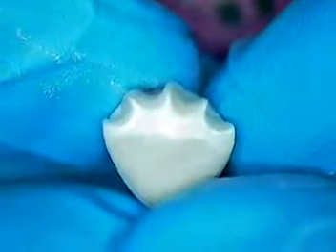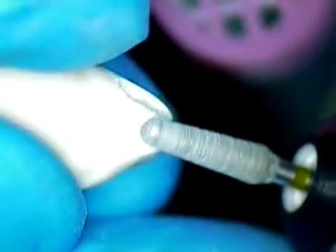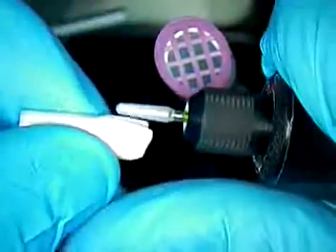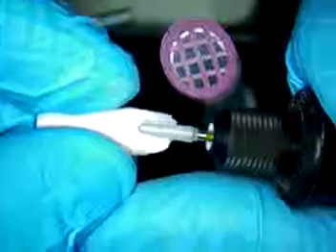That's the facial reduction done. Now I'm going to do my interproximal reduction, which is very short. Again, you want to keep the burr parallel to the long axis of the tooth. If you don't do that, you're really missing out — you're going to cause undercuts. So a quick review: here's the long axis of the tooth, here's the burr, and here's your tooth. You're working along the long axis of the root of the tooth.